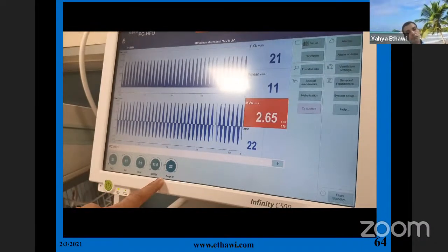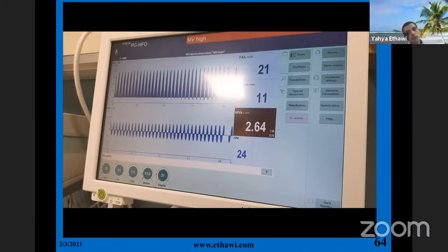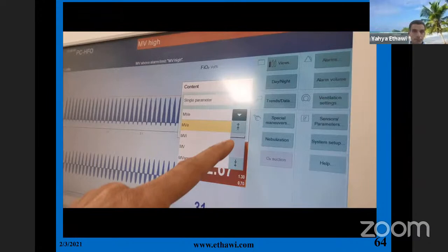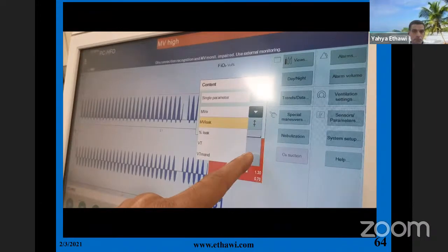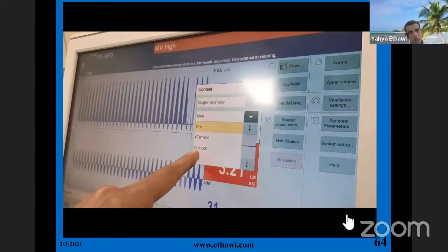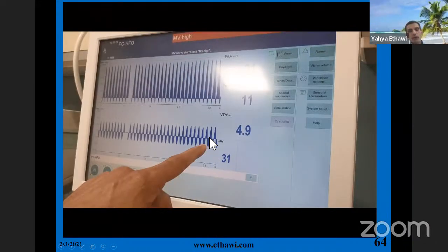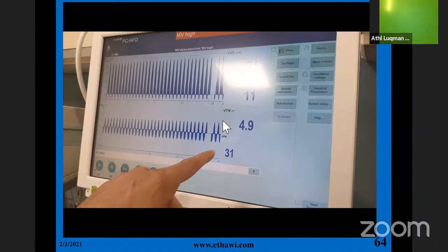this needs to be bigger. Okay. So you can even watch the tidal volume here, called high frequency tidal volume. Where is it? Here. So you can see the tidal volume. And you can see the... So still I did not add it. I was thinking that I already added the VG, but the VG is not added here.